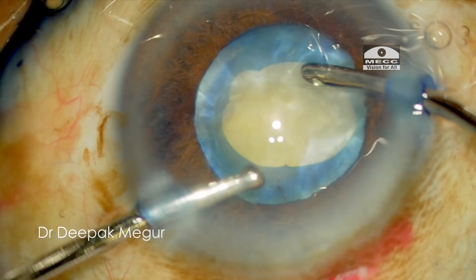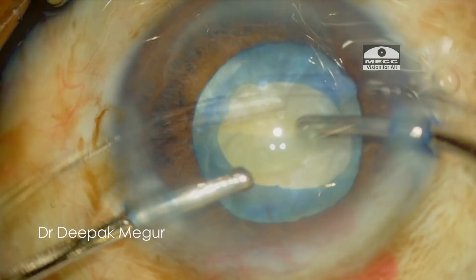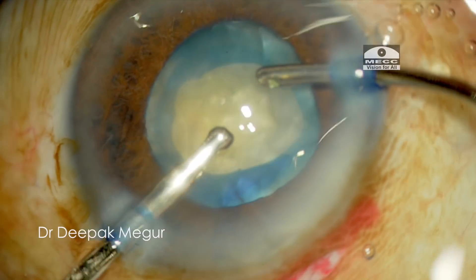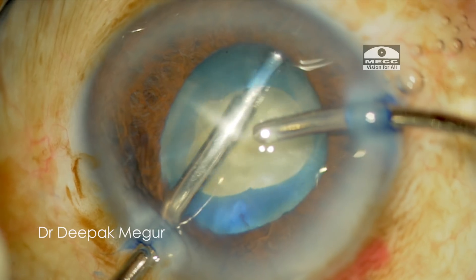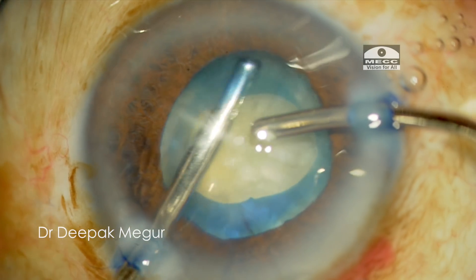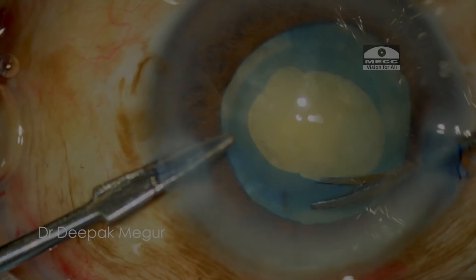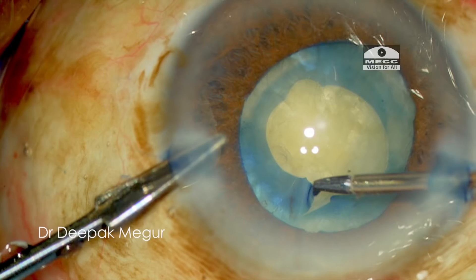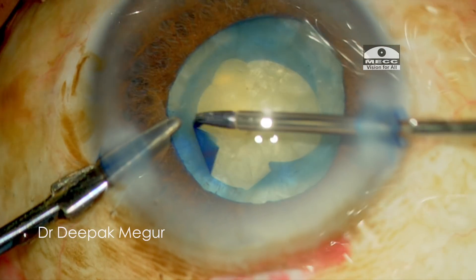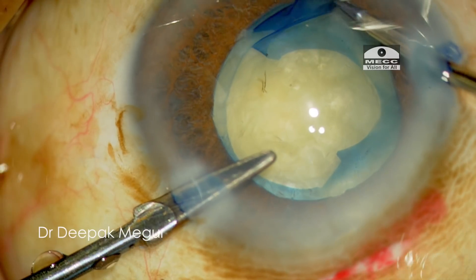Once the primary capsulorhexis is performed, it's time to decompress the capsule bag. In this case I'm using manual irrigation-aspiration to do the same. Once the intralenticular pressure is totally released, I'm performing a secondary large capsulorhexis. I use scissors to give a tangential cut to the rhexis margin and then enlarge it to the appropriate size using forceps.